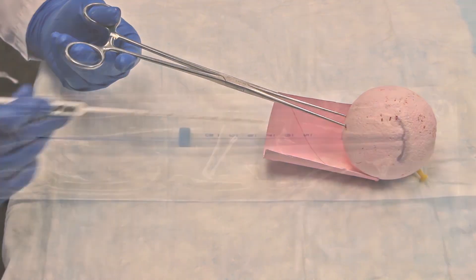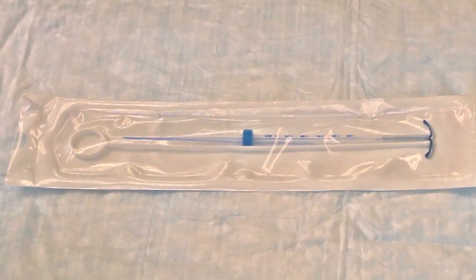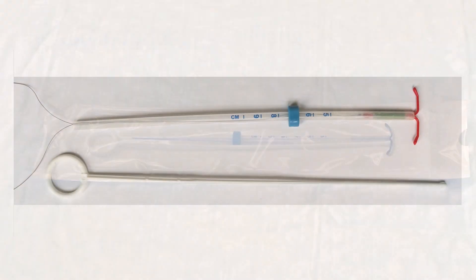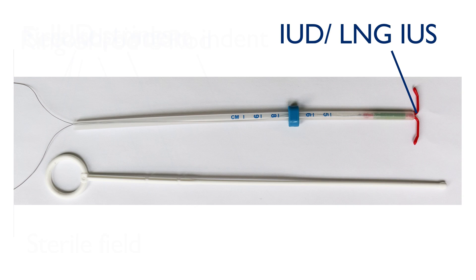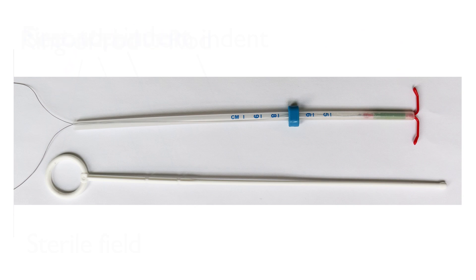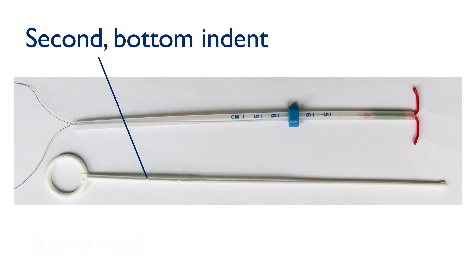Now that we have sounded the uterus, we can prepare the IUD for insertion. First, let's review the parts of the insertion package: insertion tube, flange, IUD, IUD strings, rod, ring of rod, and the first top and second bottom indents.